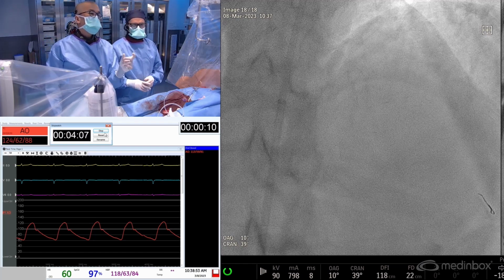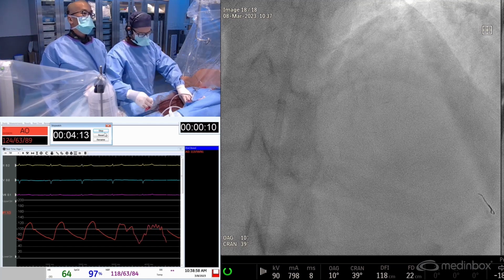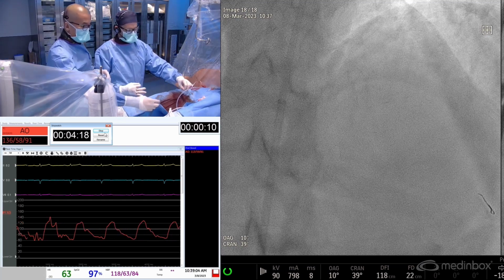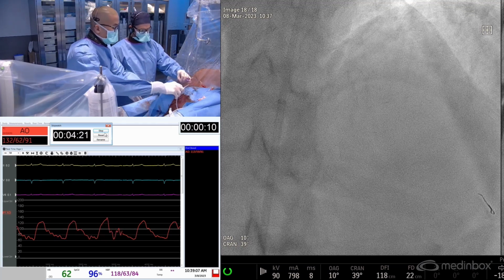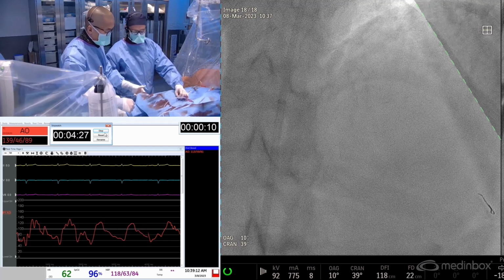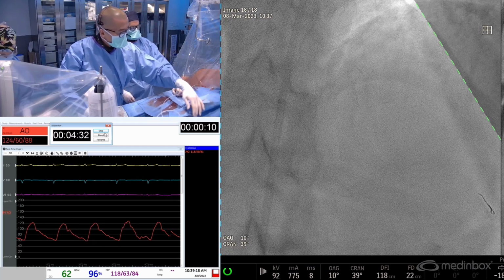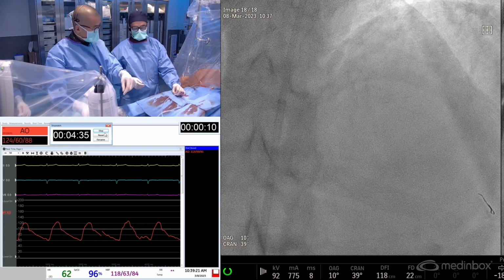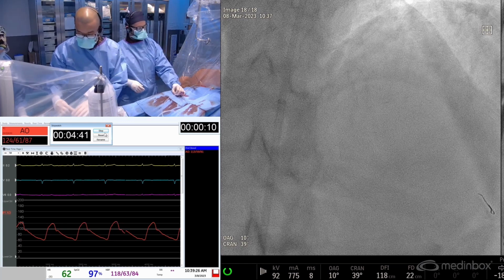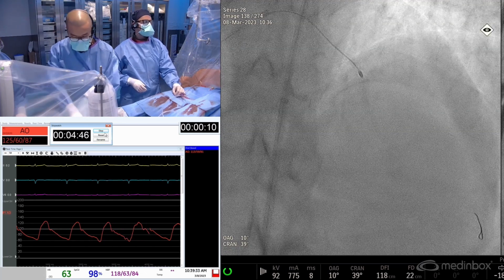So yeah, as you saw, once you pass through, I think one of the advantages that we got, it's always about having a sort of a growth mindset. We ran into some issues initially with a dissection plane in the prox LAD, and this sort of gave us an advantage because now, even with the microcatheter, you saw the Corsair Pro XS go through. Whenever you dissect through, it sort of allows us to defeat some of the calcium that is intraluminal and at the intimal level. And then we just have to navigate around the calcium, which we ended up doing.